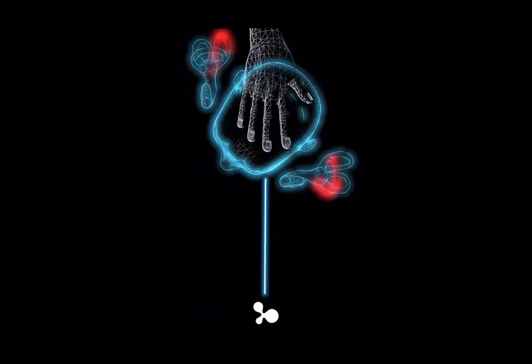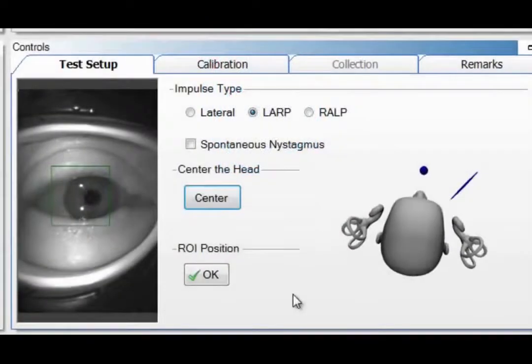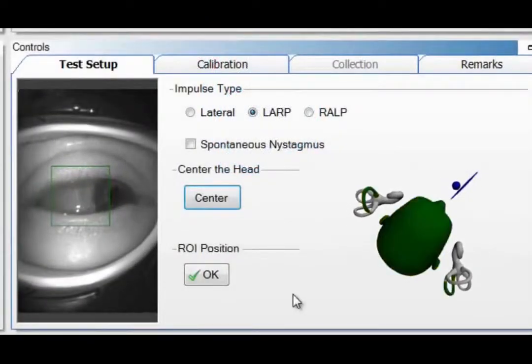Well, first let's talk about the head position feedback. This is the head that you see on your screen that is measuring your patient's head movement based on the sensor in the goggles. And therefore, when you move to 35 degrees, it turns yellow. So 35 to 39.9 degrees is yellow, 40 to 46.9 degrees is green, and 47 to 49.9 degrees is yellow again. The minimum is to be in the yellow range. It's ideal to be in the green range. So the head position feedback is a guide to help you position the patient's head in the optimal range.